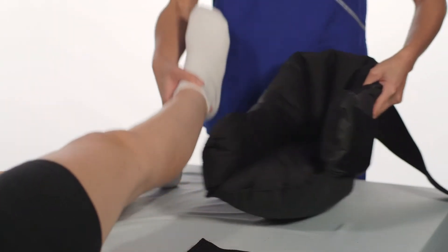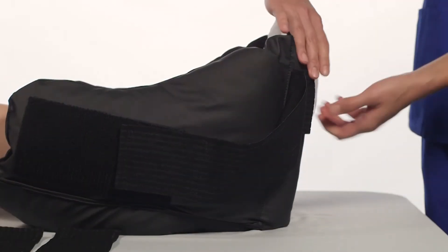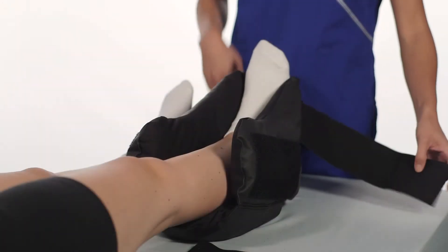Gently place the patient's foot into the boot, making sure that the heel is placed over the heel opening. The DeRoyal sew-in label should be on the outside of the device and should not touch the patient or rest on the surface of the bed.